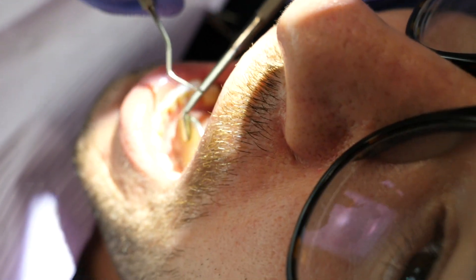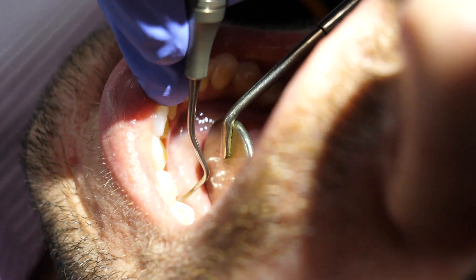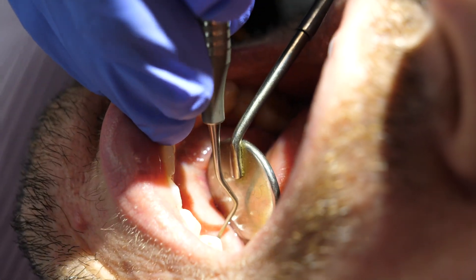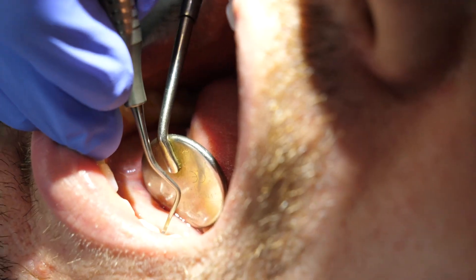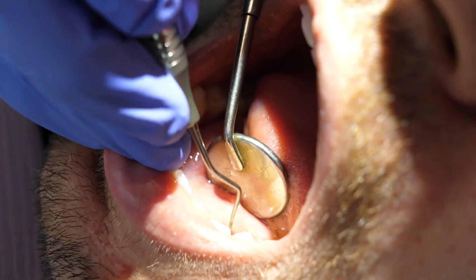Sometimes calculus can be burnished, right? Whether it's burnished or not, I usually next go in with a curette. But especially if it's burnished, curettes seem to help because you can kind of remove layer by layer a little better.